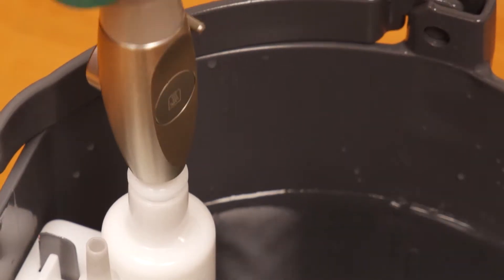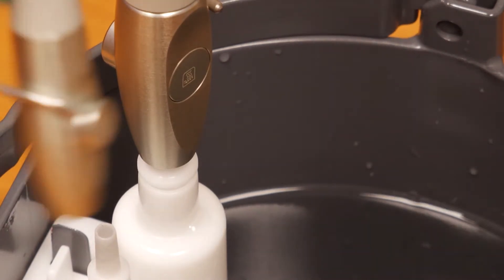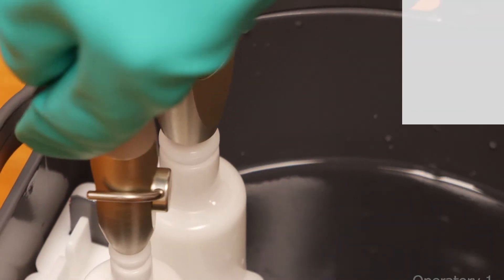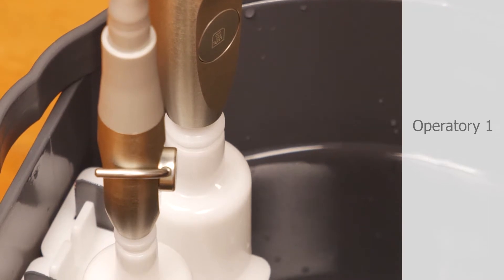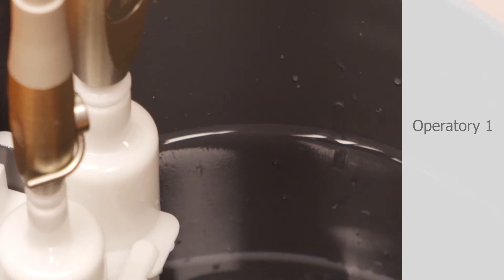Start with the operatory that is the furthest from your central vacuum pump. Attach the high and low suction lines to the dispenser valves and allow it to suction one quart of solution or until it reaches the next measuring line.